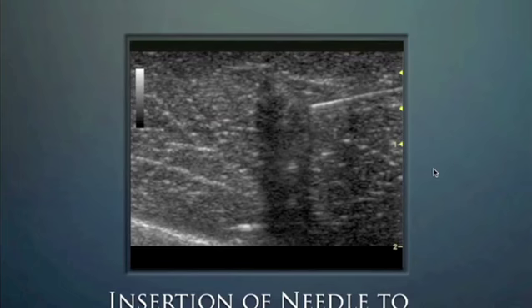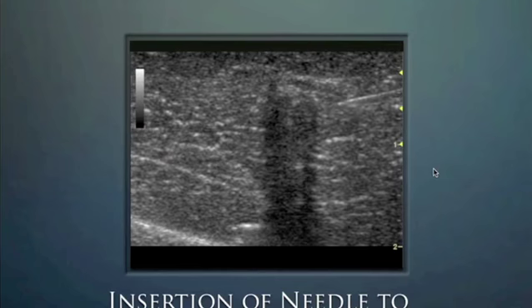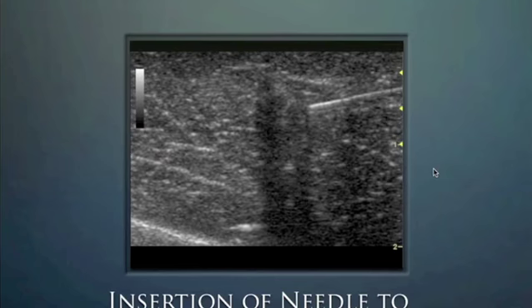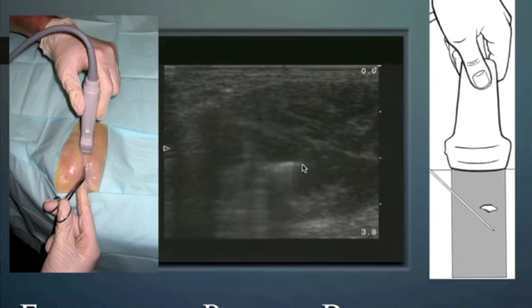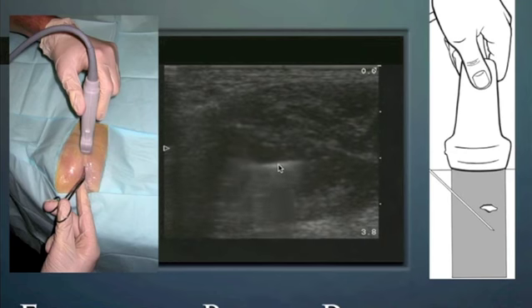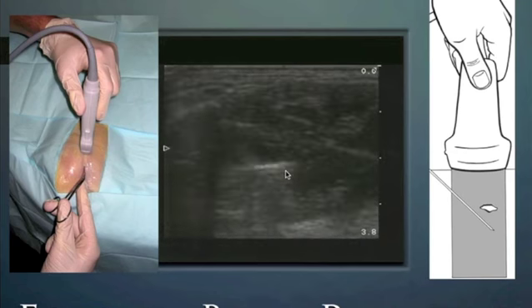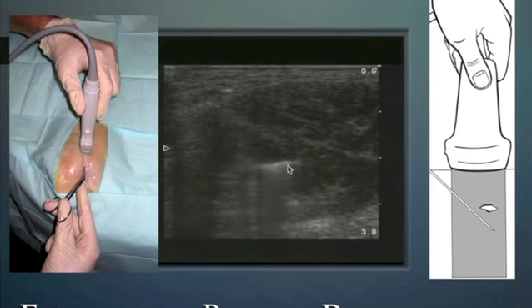This patient had a needle break off in their buttocks during an immunization years ago, and they came in because it was particularly discomforting on that particular day. When they arrived, we took a look with ultrasound and found this needle about 2 centimeters. These are 1 centimeter hash marks.